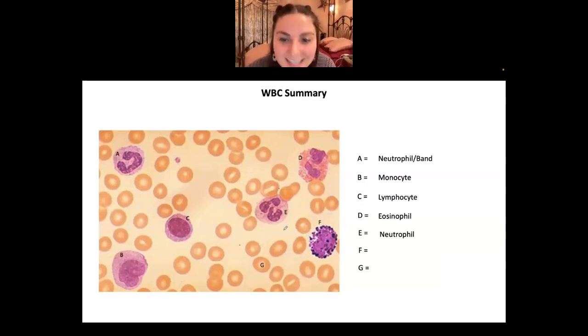So this is a basophil. Very good. This is not a mast cell. Mast cells are only in the tissues. If you're in a peripheral blood smear, you should not see mast cells. So between the two, blood smear, blood, basophil. Okay, very good. So the giant purple granules, you can't even see the nuclei because of how big the granules are. Awesome. You guys are little hematologists.